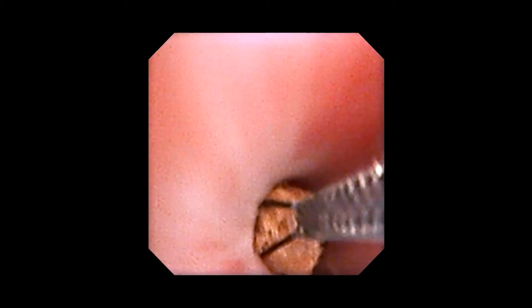I was very fortunate. Breaking up the stones at the lower power prevented them from ricocheting away from the laser, and actually speeded up the fragmentation process. I was able to reinsert the scope several times. Once I basketed out the larger stones, we did voiding urohydropropulsion twice to remove these fragments, and got all of the fragments out.